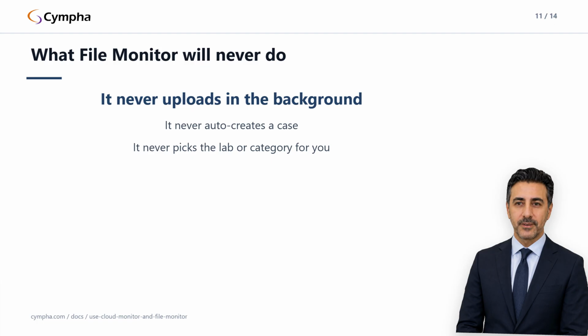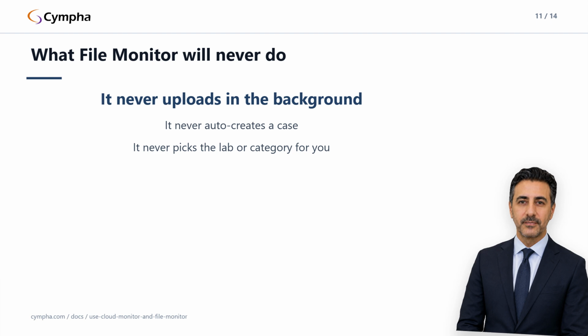The entire purpose of the feature is the prompt. Surface the file the moment it lands, so nothing gets forgotten in an export folder, and leave the human in the loop for everything that matters. If you've been hesitant to point an automated tool at your patient data folder, this is the part to hear. Watching is all it does until you say otherwise. The convenience is in the noticing, not in any silent action.